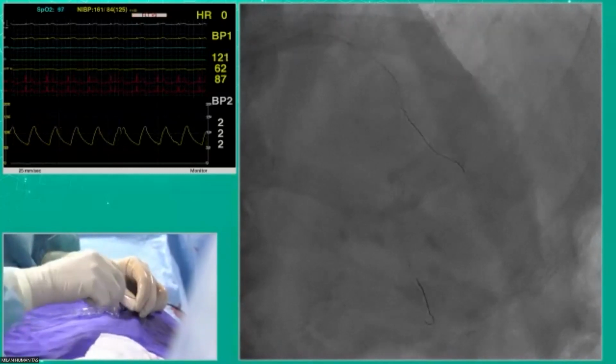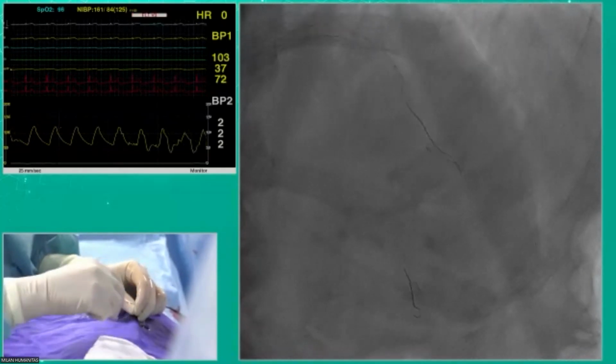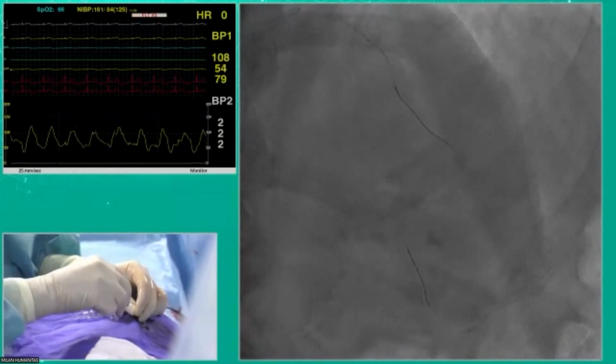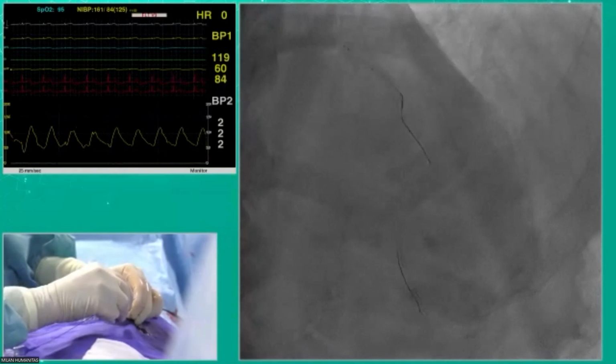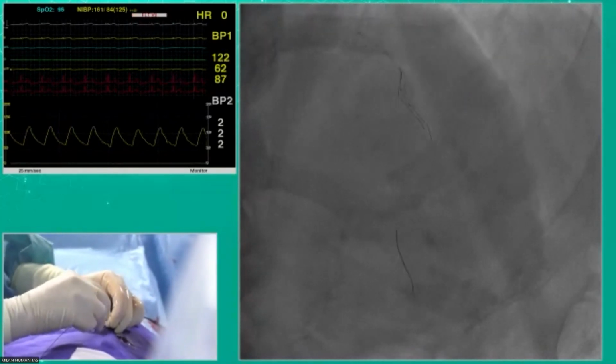What are you doing now, Ajay? We don't have drug-coated balloons in the U.S. So we're stuck. But, honestly, I try not to stent beyond that diagonal in the LAD because, I mean, the patient's 84. If the patient were younger, you run out of options.